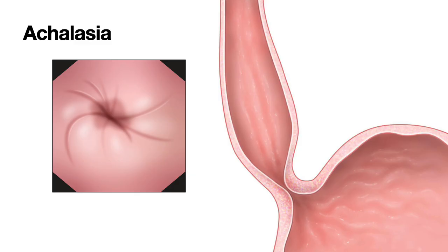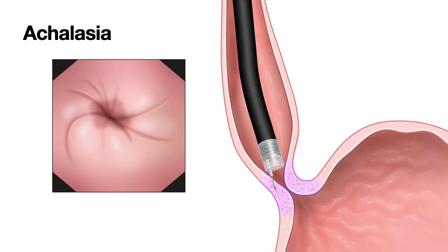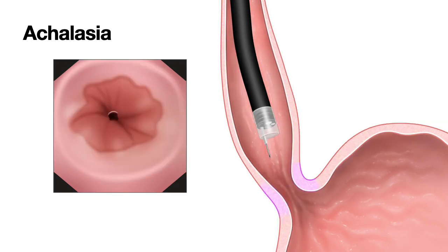So how do we go about injection of the lower esophageal sphincter? As you can see here, the lower esophageal sphincter is tight, and you insert the endoscope, you have the needle primed with Botox, and the endoscopist comes to the lower esophageal sphincter and pushes the needle into the lower esophageal sphincter and starts injecting 25 units into each quadrant. So 12 o'clock, 3 o'clock, 6 o'clock, 9 o'clock. And after the injection, the needle comes out, and usually very quickly you would notice that the sphincter has relaxed.